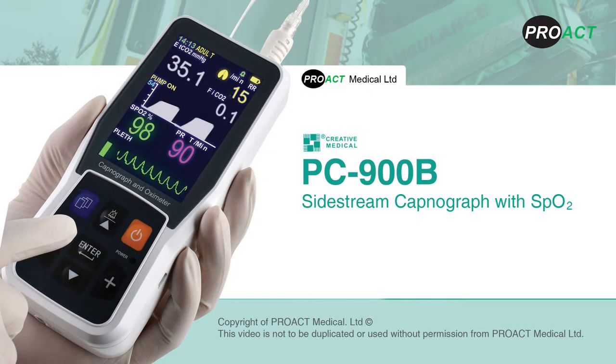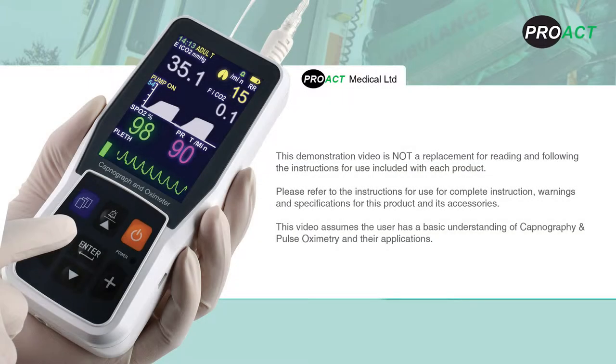The Creative PC900B Capnograph, available from Proact Medical. This demonstration video is not a replacement for reading and following the instructions for use included with each product. Please refer to the instructions for use for complete instructions, warnings and specifications for this product and its accessories.